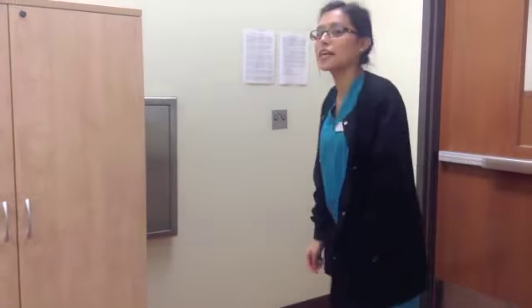Okay, so after leaving the processing lab, we are going to change into our clinical clothing, which follows the OSHA guidelines. And we are also going to check the patient's schedule just to see what they're going to have on for today. So after we check the patient's daily schedule, we are going to prepare the treatment room for our first patient. We're going to check for any supplies, put barriers on, and check if the water service has water.